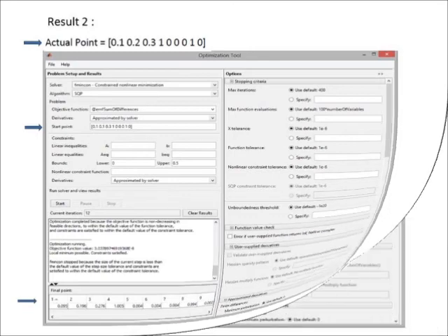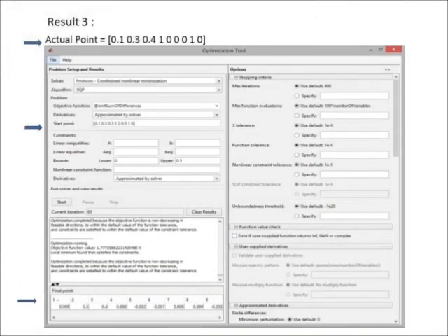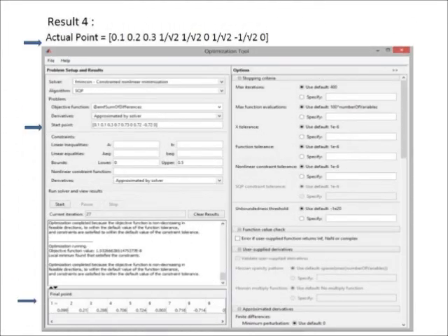The third test case has a different initial point at point 1, point 3, and point 4 with the same orientation, and also demonstrates successful results. The fourth example is of using different orientation. The initial guess must be very close to the actual value in order to get close results.